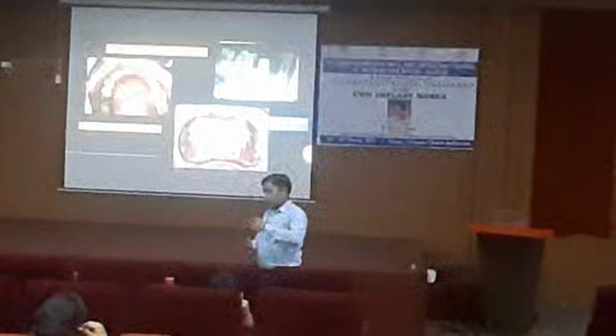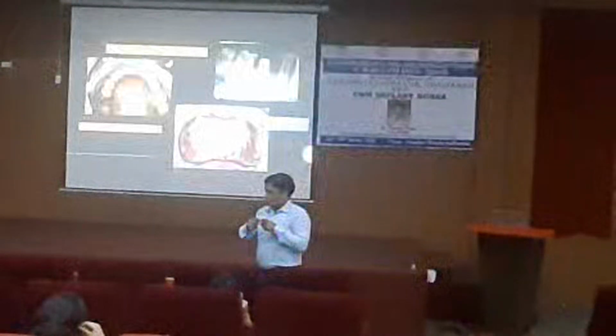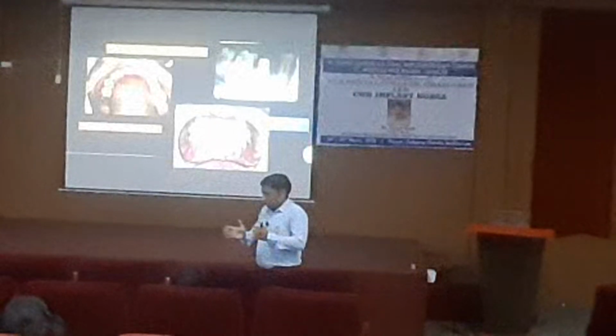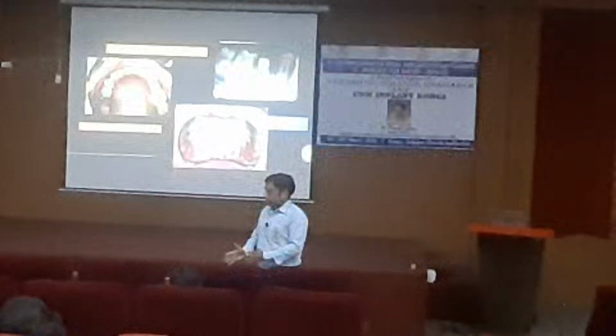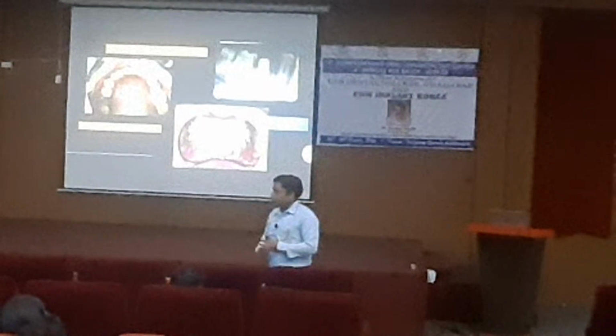It is a ring, it's not like only a cover. It's like a full vertical depth. Okay, so fix it into the socket. It will get fixed. The outer envelope is a little bigger and the inner one is smaller, and you have fixed it inside. It is the male-female type. You fix it inside the socket and then you place your implant. Okay?